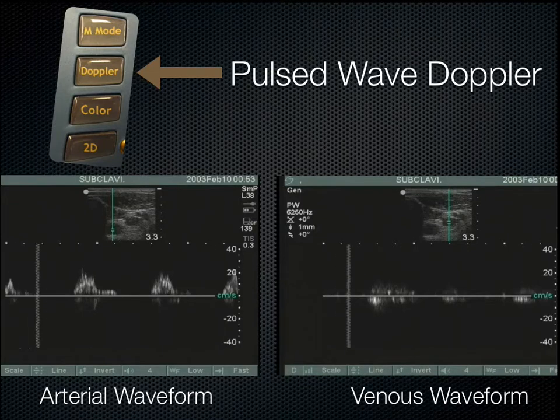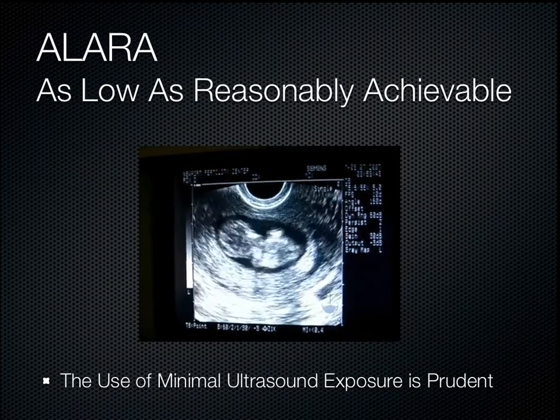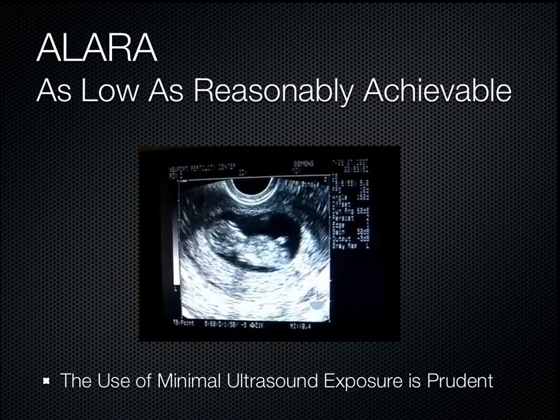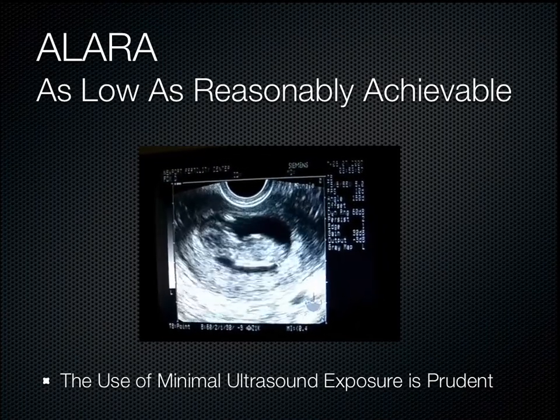Now, what about the concept of ALARA? ALARA means as low as reasonably achievable, and it's a holdover from other types of imaging modalities in which radiation or gigantic magnet is used, and you want to expose the person to as least amount of radiation as possible.